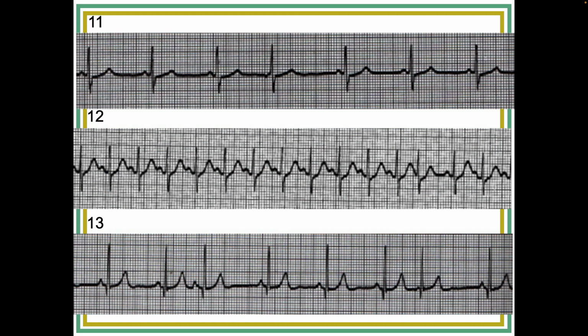Okay, number 11, Cody, this one's yours. For number 11, I did the boxes method, and this one I struggled doing the boxes method because there was not a set lined up perfectly. Right, I agree. But I believe it was borderline sinus brady.